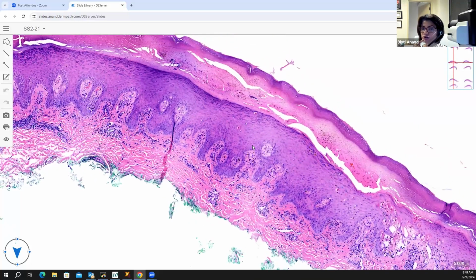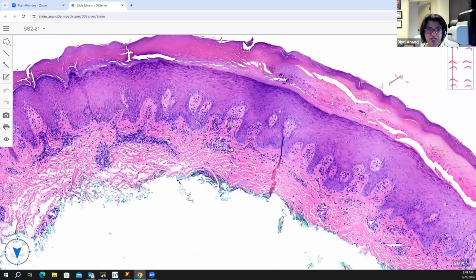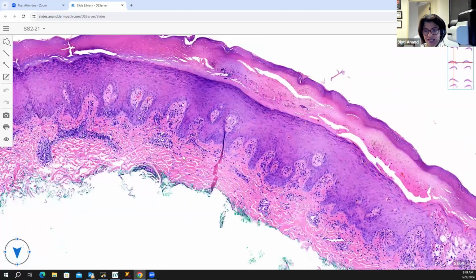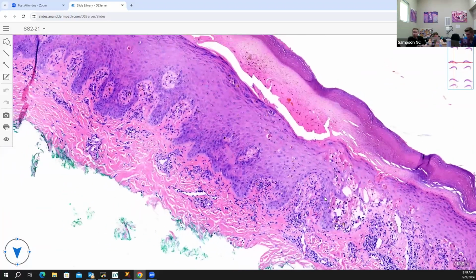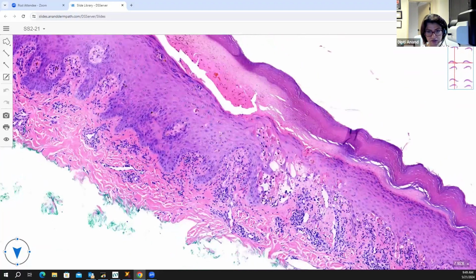Yeah. So you differentiate between the two because, first of all, do you see how in pityriasis lichenoides a more prominent feature is lymphocytic exocytosis? The necrotics actually are not that prominent. Here you can actually see high level necrotics. You see that? So to me, EM and fixed drug are somebody sitting down in the dermis and shooting at the epi. So when you see necrotics at varying levels in the skin, that really makes you think about EM or fixed drug.